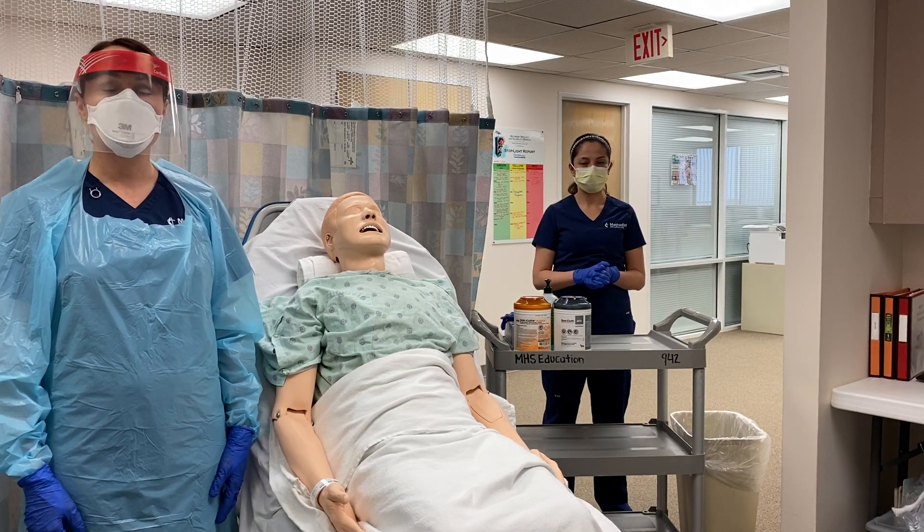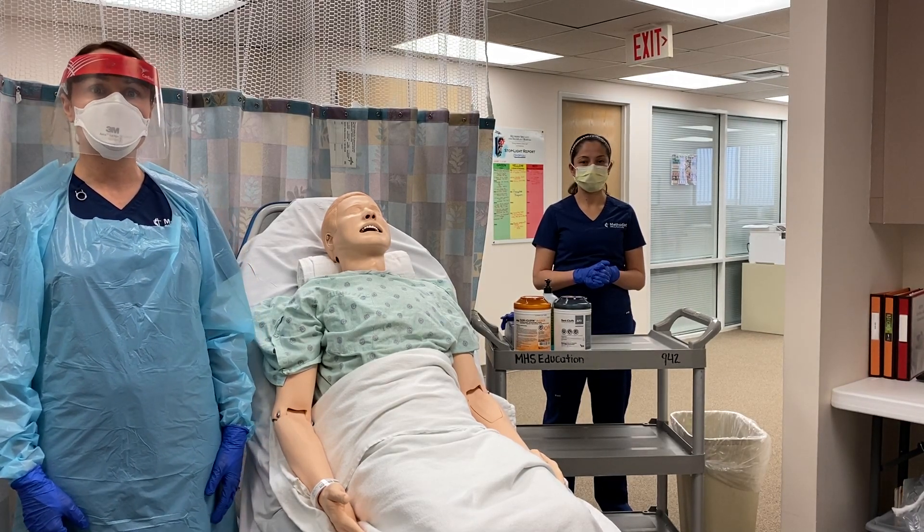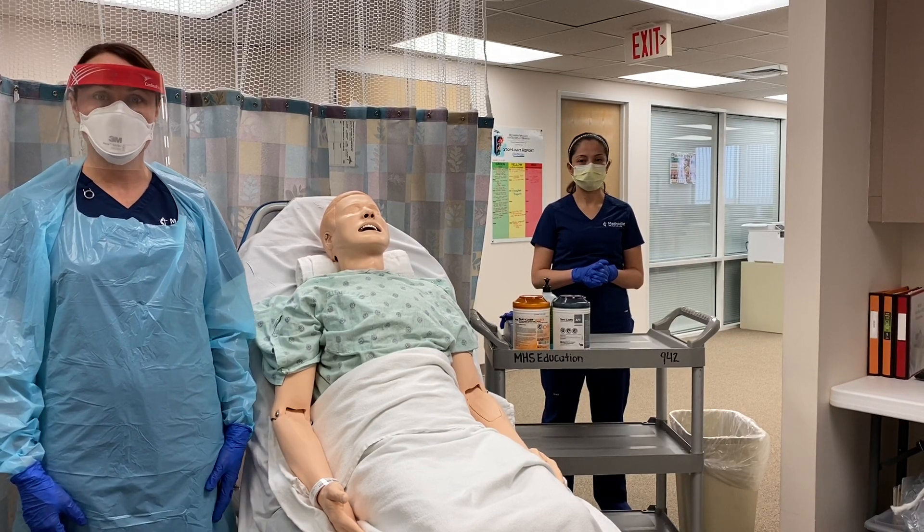In today's video we're going to show you the correct way to perform a nasopharyngeal swab for COVID-19 testing.